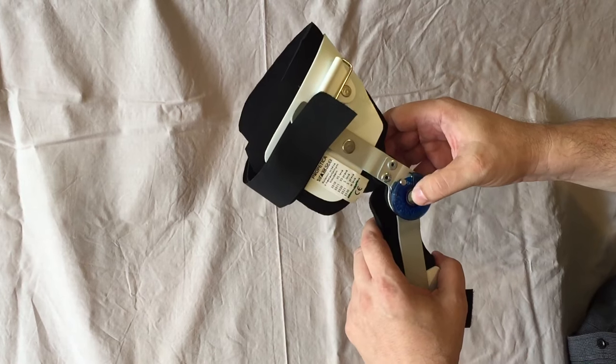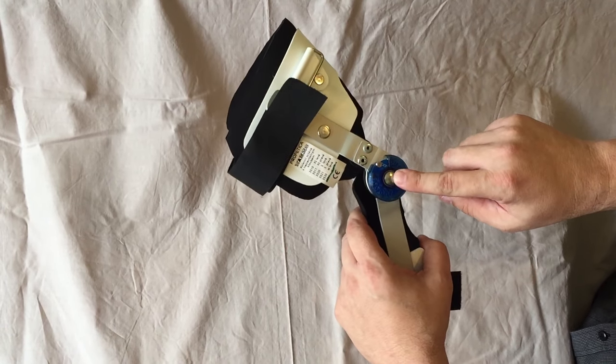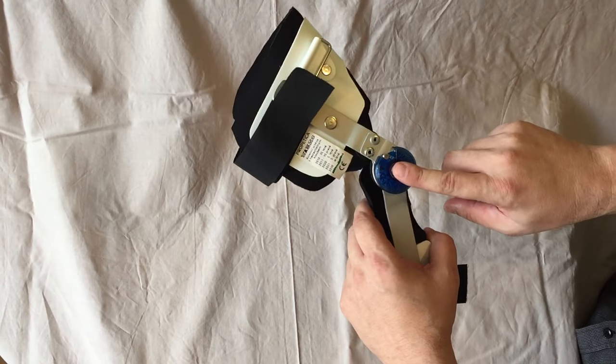Here is the adjustable joint. How to work with this joint will be explained in a separate video.